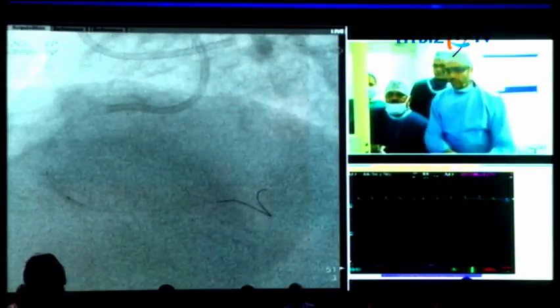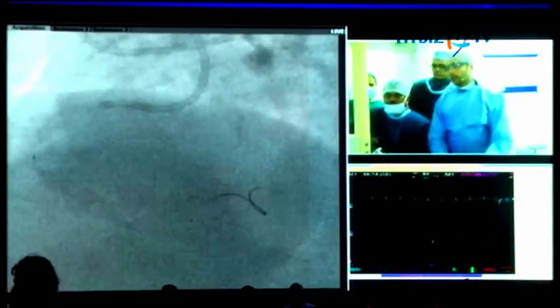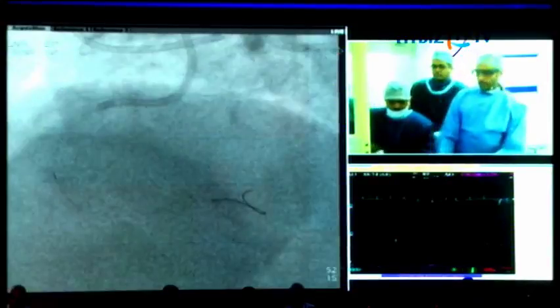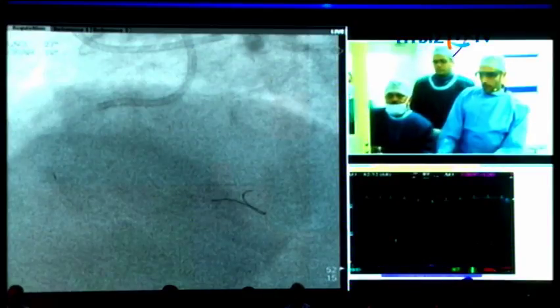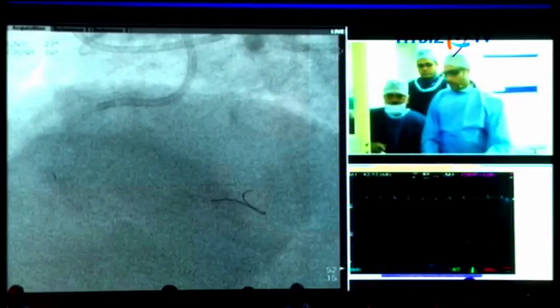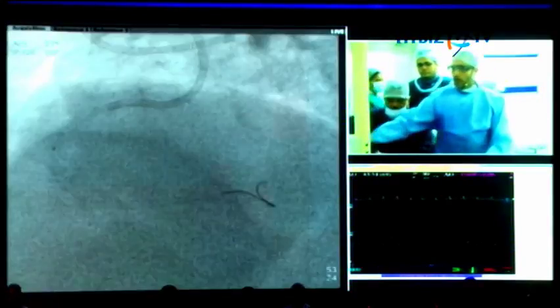Okay, Arun, Dr. Galassi has something to say. Yes, Dr. Galassi, can you give the mic? I think that at this stage it's wise to stop and let the artery seal by itself, and then wait a few months to re-angio.